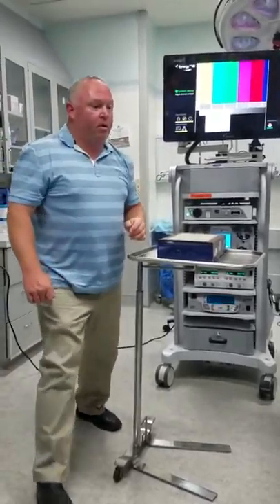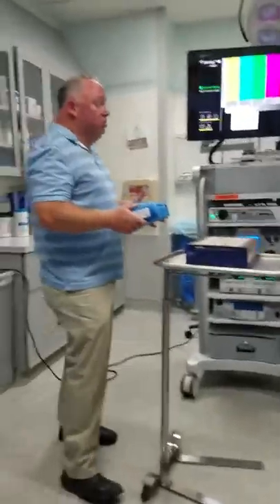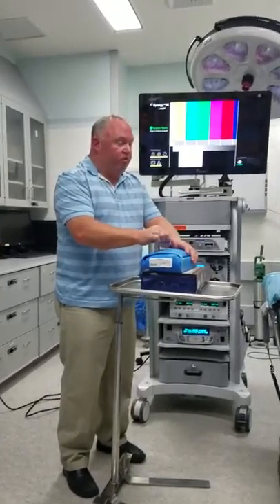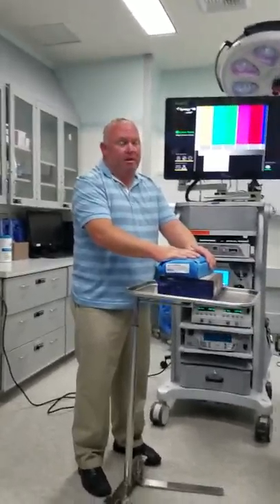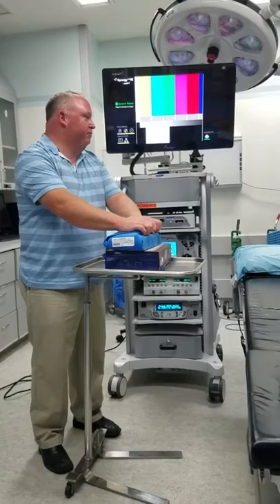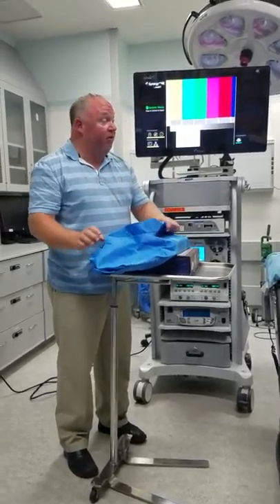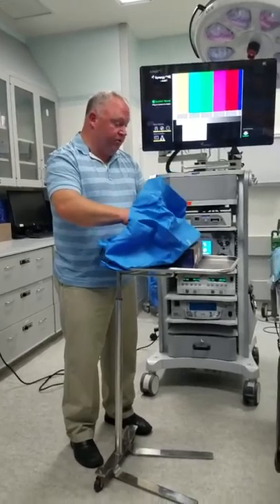Eric, how small of a person can you do a scope on? Well, they have different size scopes. So they have mini scopes, would be for a wrist or an elbow or an ankle. They're much smaller, the smaller joint, as you can see. They typically don't do scopes on children. Not for peds, I haven't seen them. I'm sure there's probably some peds specialists that do. Typically, I've not seen too often. Yeah, I'm just curious. But yeah, it could happen, I'm sure.